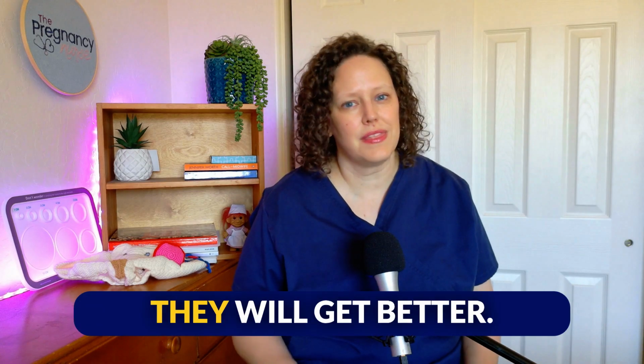So I don't want you to think that wireless monitors are the end all be all, or if your hospital does not have wireless monitors, which is true for a lot of hospitals across the United States, they're very expensive, and the stickers we use are also very expensive. And so a lot of hospitals really can't afford them. So while I think it's amazing, this is technology that is evolving, although I gotta say they put out a new unit, I think last year, and people were saying they thought it was worse than the old unit. It is a tricky thing, and because there is so much litigation in labor and delivery, there really are only a couple of companies even dipping their toe into this thing. So hopefully with time, they will get better.